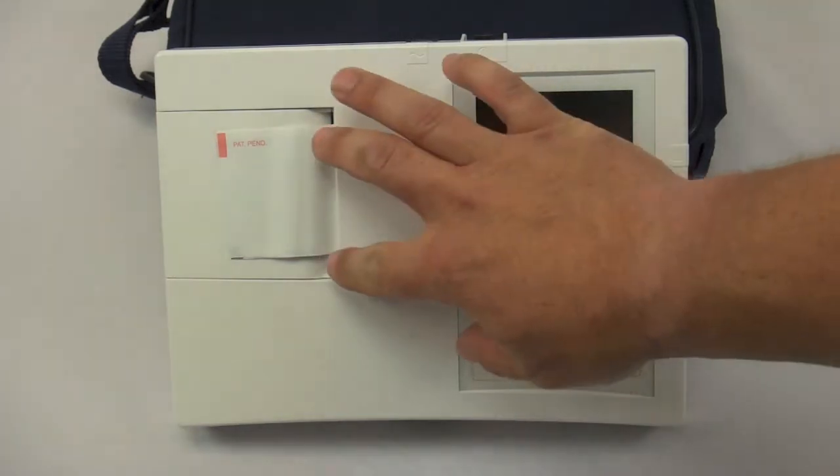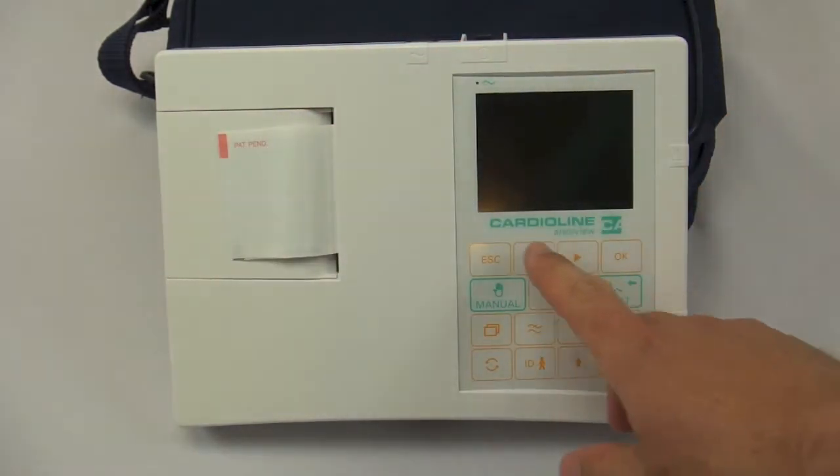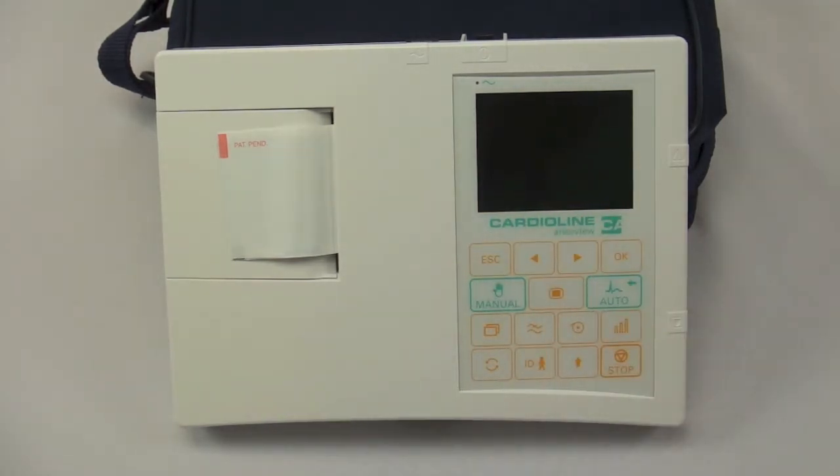The AR600 features a three-lead printer and a small strip print. You will notice that the AR600 does not have a keyboard — it does have a small keypad but does not feature a more traditional full keyboard. The AR1200 and AR2100 products do offer that, and we have separate videos available for those devices.